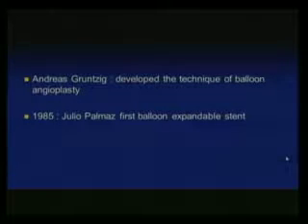This stent is still being used, and we use it most of the times for the type 1 endoleak, repairing the abdominal aortic aneurysm. We used it recently. It's the same way he had done it, so it's still being used.